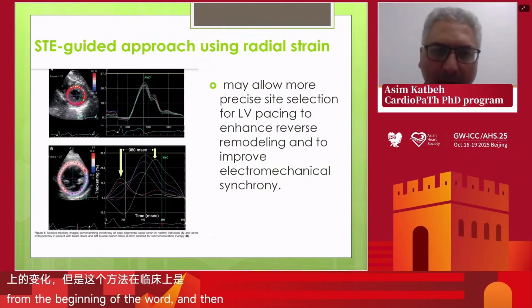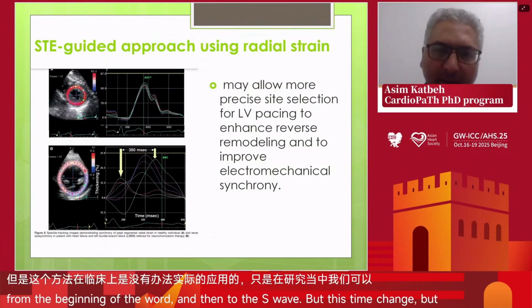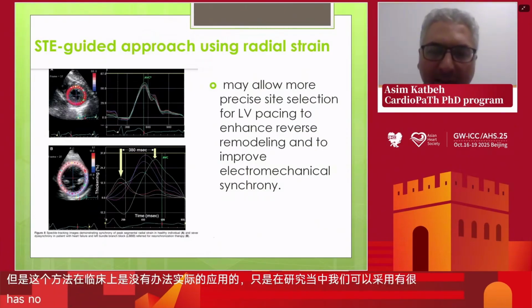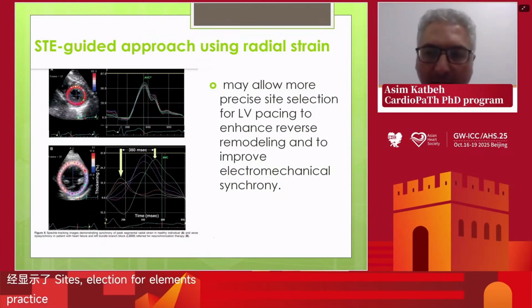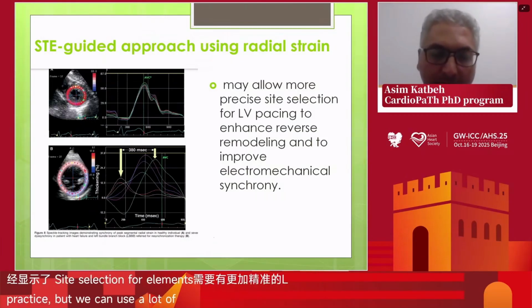Right now, I would like to focus on strain, and many studies demonstrated that the radial strain might allow more precise site selection for LV pacing to enhance reverse remodeling and to improve electromechanical synchrony.